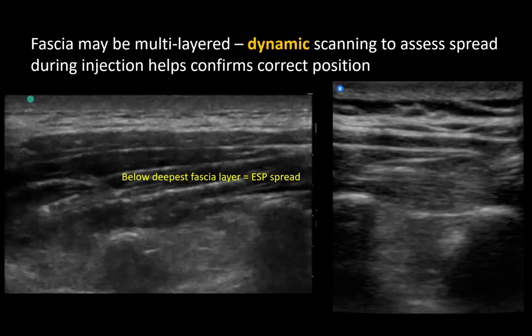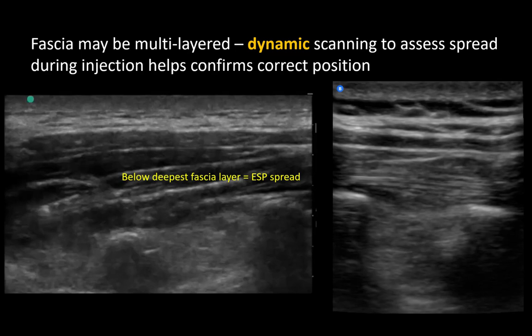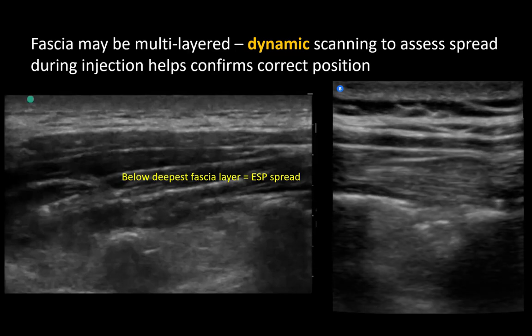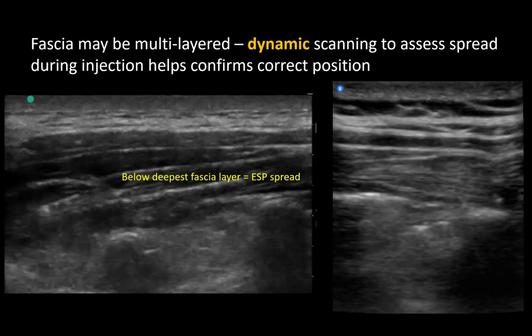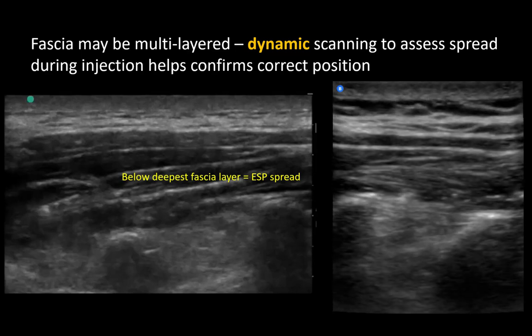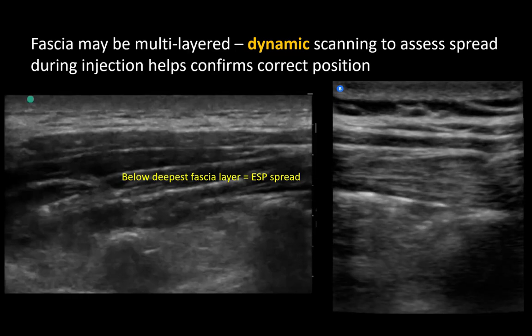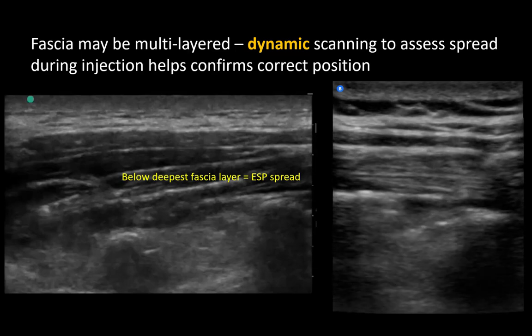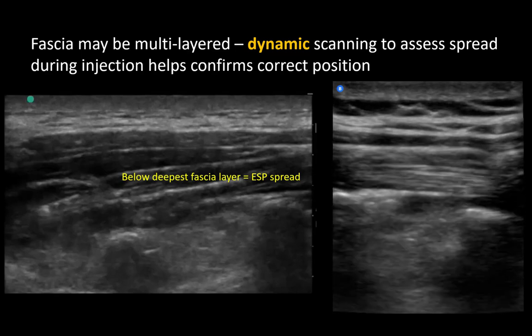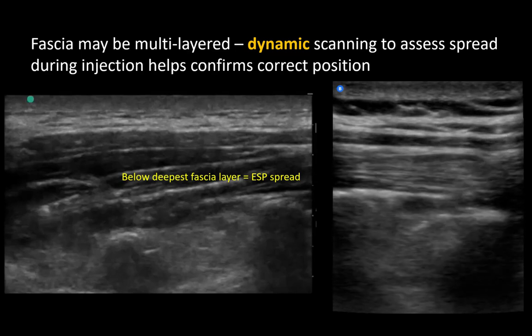The second video on the right further illustrates this process. Here you see the needle tip advancing through the muscle and piercing the fascial layer that runs over the transverse processes and the intertransverse tissues. It's not clear with the initial injection that the fluid is spreading below, so the probe is manipulated to scan and see a clear demarcation of the fascial layer as well as the fluid spread below it. Here we see a clear fluid spread with a linear pattern that lifts the muscle.